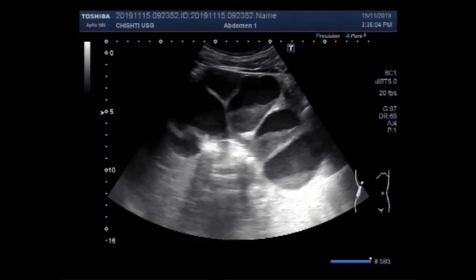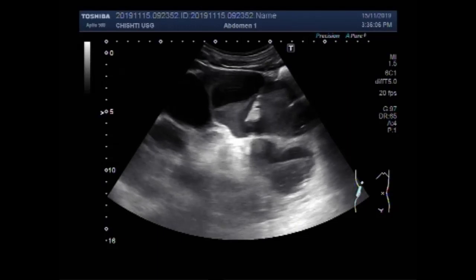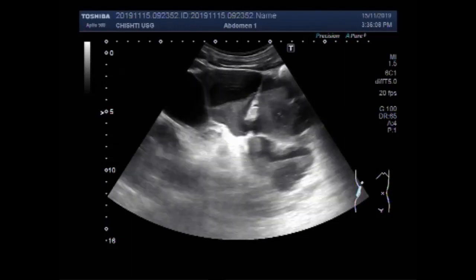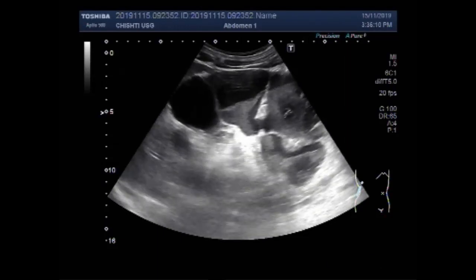Dear viewers, I hope you are all fine. This ultrasound video shows pyonephrosis of the kidney.